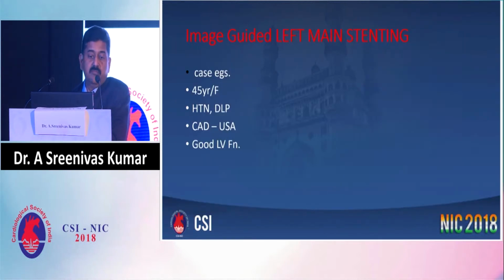I think before I close, I would like to show 1 or 2 cases. Basically, I selected one case of osteal left main, one of crossover type, and one of osteal LCX. This is a 45-year-old female, hypertensive and dyslipidemic, with recurrent chest pain.